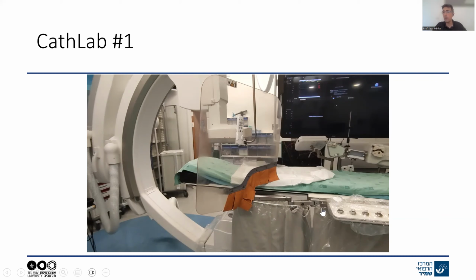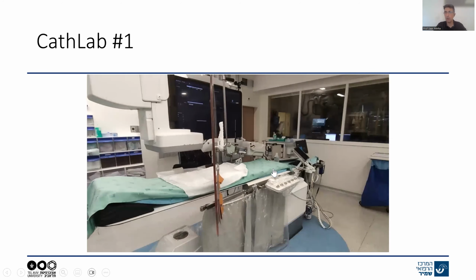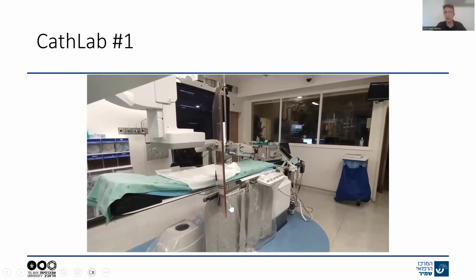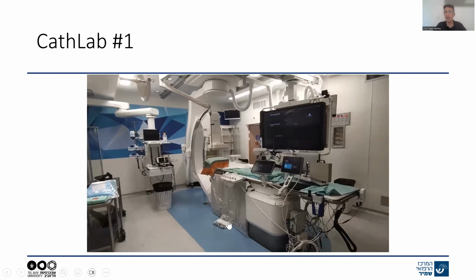This knob, when I push it downwards and maneuver it forward, backwards, left, and right, moves this floating table. And one important aspect that I will show in a second is the foot pedal. So there's a foot pedal here on the floor. You can see that in a second, hopefully. Let's see if I can zoom out, and if not, we'll see it from the top. Okay, so the foot pedal here is the way I control the energy.